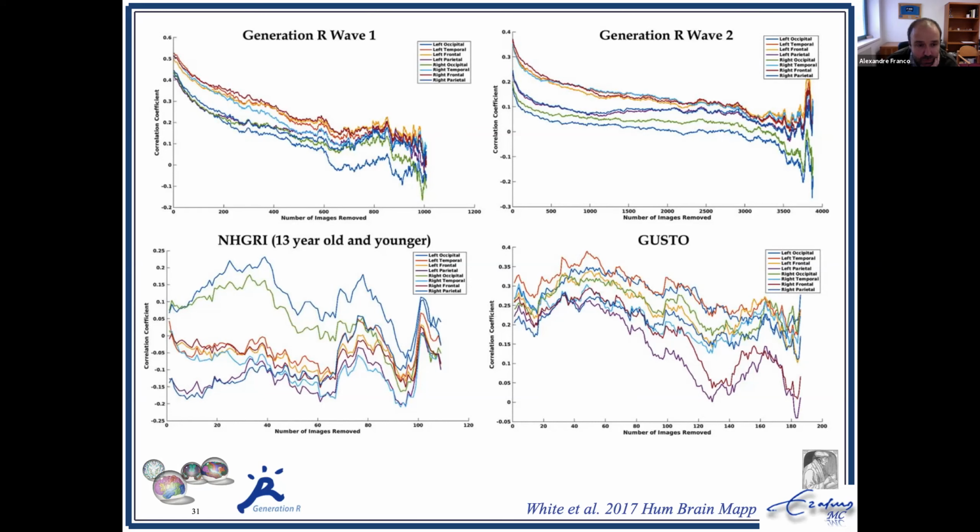We've worked on some data looking at FreeSurfer, and cortical thickness from FreeSurfer is an extremely sensitive measure. Of the FreeSurfer measurements, it's the most sensitive measure for any little motion. Even if you have zero motion, you do have a lot of variability in the quality of cortical thickness. The other FreeSurfer measurements are pretty robust and do very well.